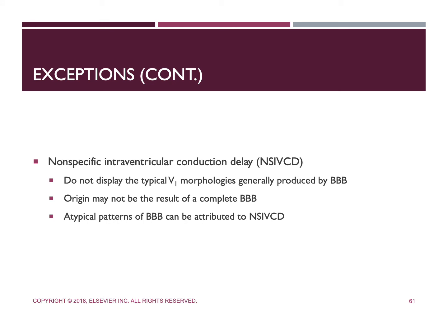So when it comes to differentiating between the left bundle branch block and the right bundle branch block, a third category sort of does exist. And that's non-specific intraventricular conduction delay, or what we call NSIVCD. So once again, non-specific intraventricular conduction delay, NSIVCD. And these blocks do not display the typical V1 morphologies generally produced by our bundle branch blocks.